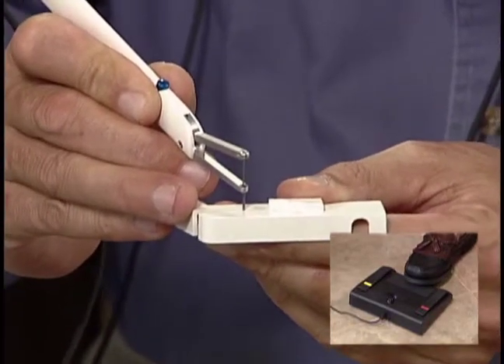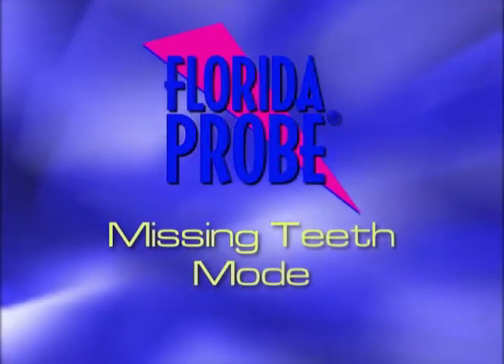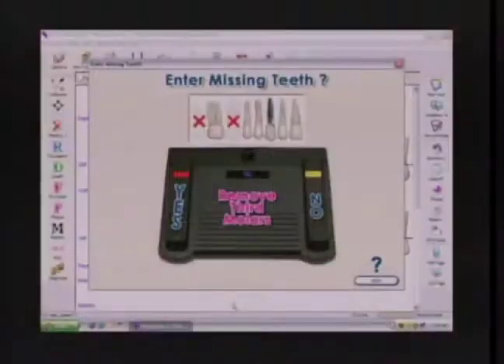Notice I pause for just a moment, release it to its full extension, just like the graphic, and step again. The most common mistake that people make in calibrating is doing their hand and their feet at the same time, stepping and releasing. That's why I make a point of pausing between the two steps. It now has taken me into the next mode, which is to record the dentition.